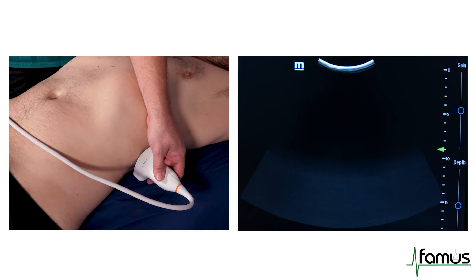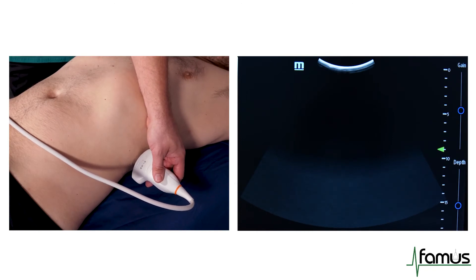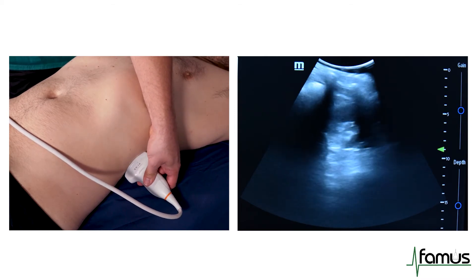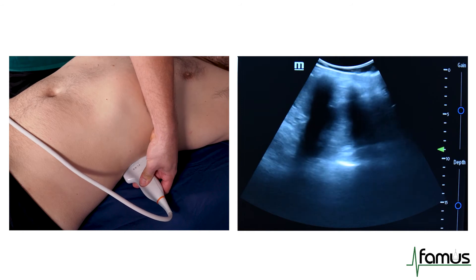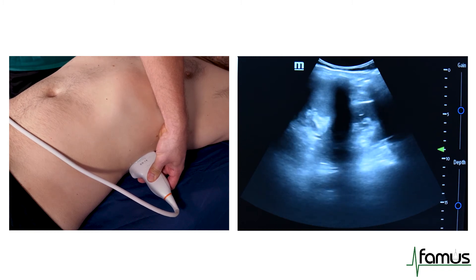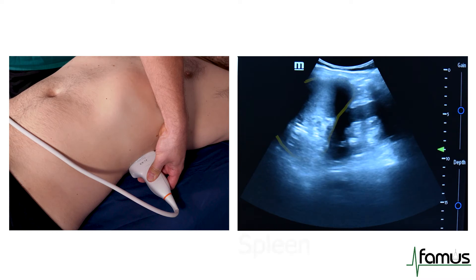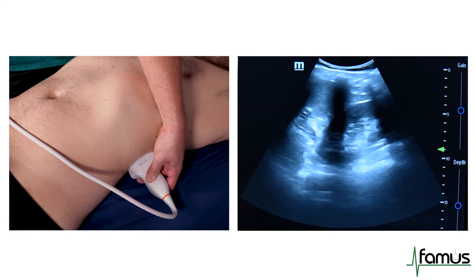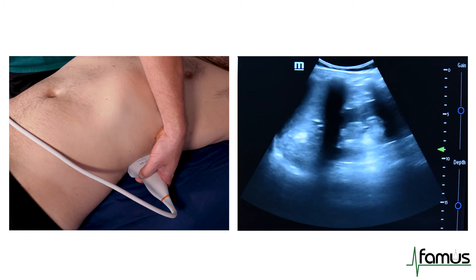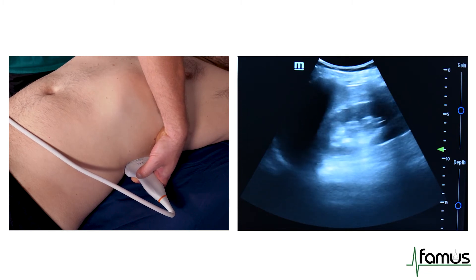The next view of the abdominal examination is the left upper quadrant. We want to be at the posterior axillary line, marker dot towards the head. We can see the spleen and the kidney appearing on the screen. Rotation of our ultrasound transducer can help to get rid of the rib shadows and we can see the kidney fully.